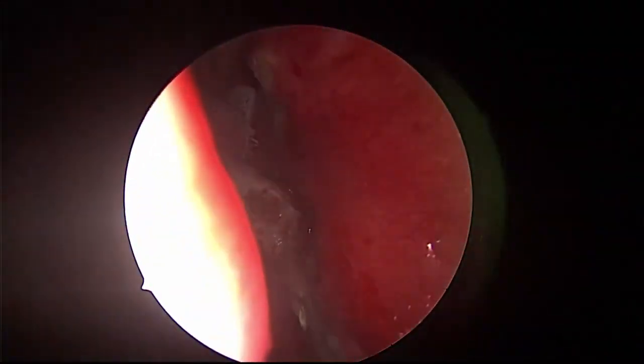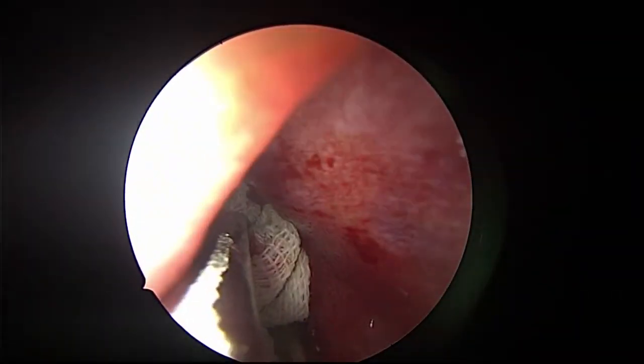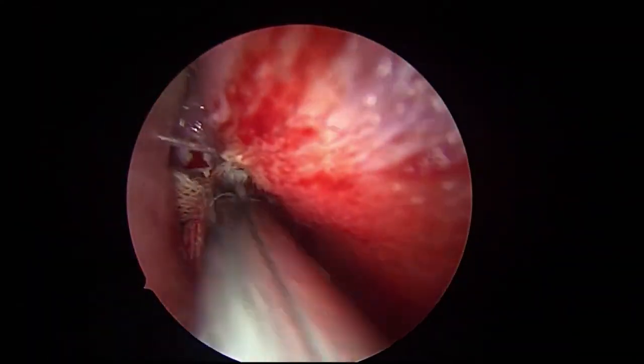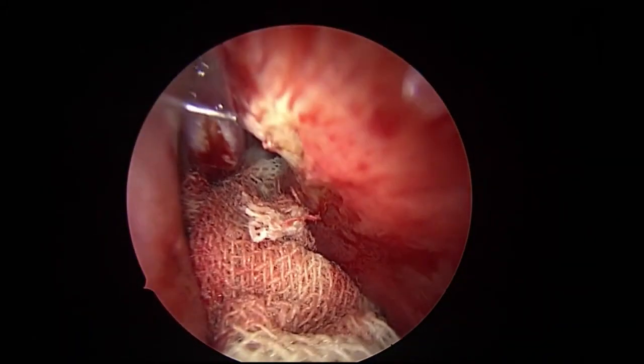See this? Before doing the dissection, this surface coagulation is very, very important, because sometimes your instrument may inadvertently poke into the tumor. Problem.